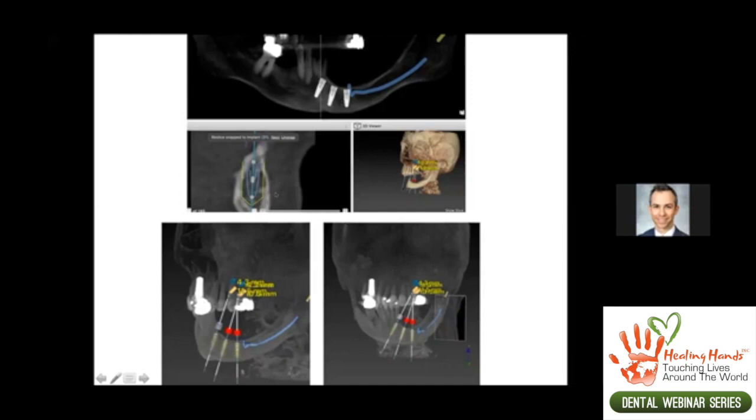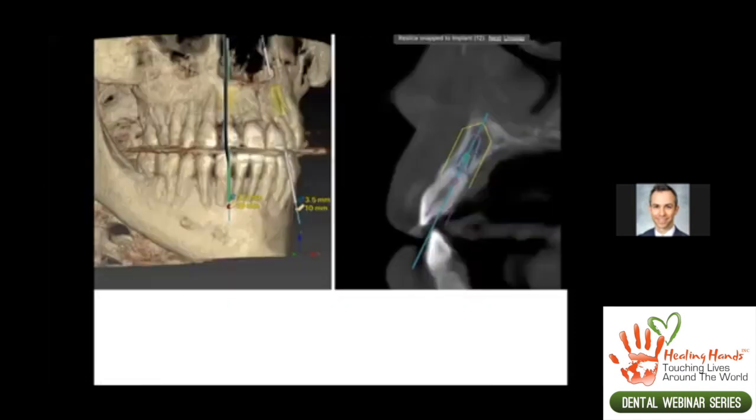And in this case, we see that when we place these implants further apically, we do have at least 1.5 millimeters of bone around the implant on all sides. So we can make this work and kind of come up with a compromise. And this requires great communication between surgical providers and restorative provider.